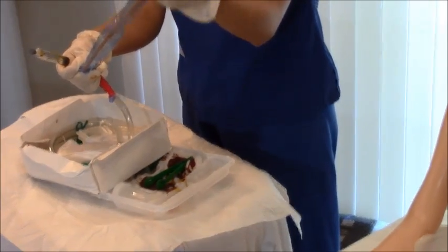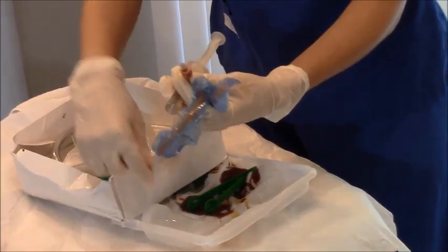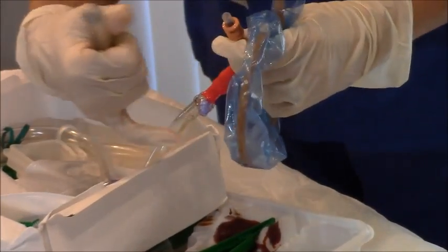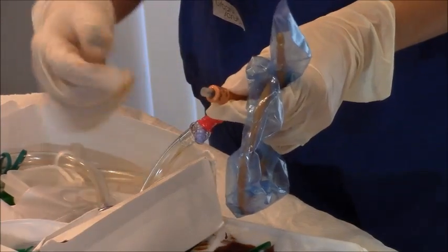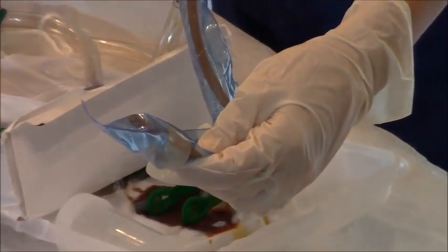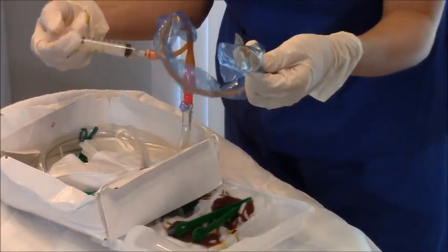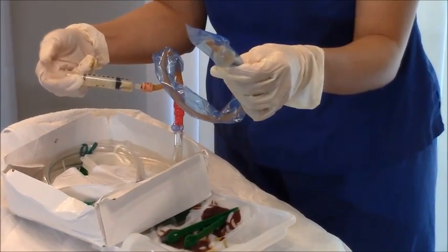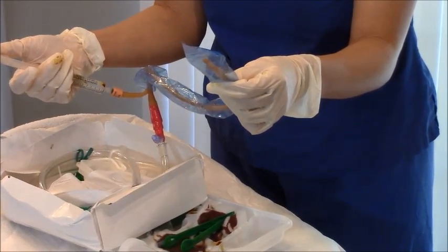There are two ports on the catheter — one for specimen access and one for inflation, which typically takes 10 cc's. Connect the syringe to the inflation port and watch the bulb to make sure it inflates properly. Insert all the sterile water and inspect the bulb for leaks. Then let go of the plunger on the syringe and watch it deflate — I usually observe for about 15 to 30 seconds. If it deflates correctly, it works great.